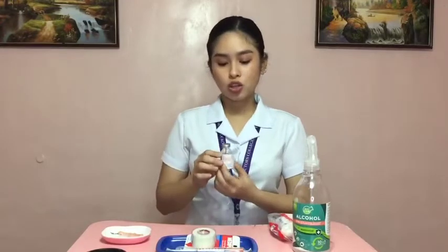So now let's prepare the medication vial for drug withdrawal. So first things first, let's mix the medication by rotating it in our hands and not by shaking. Then after this, let's remove the cap or clean the rubber cap if the vial was previously opened. So this medication vial was previously opened, so let's rub this with the antiseptic swab or antiseptic wipe, rubbing it in a circular motion.